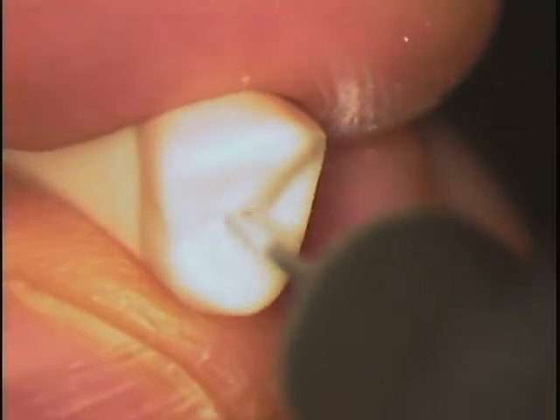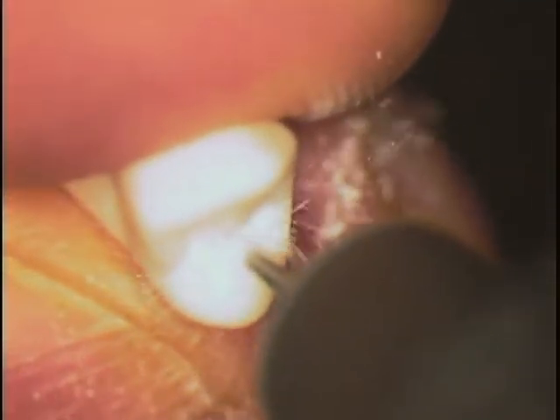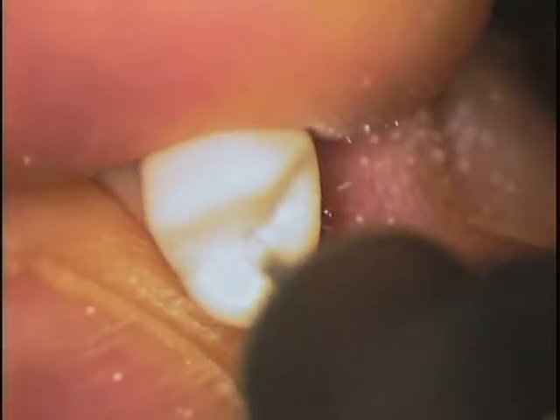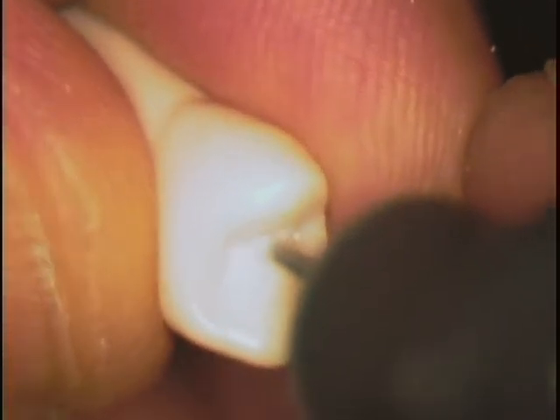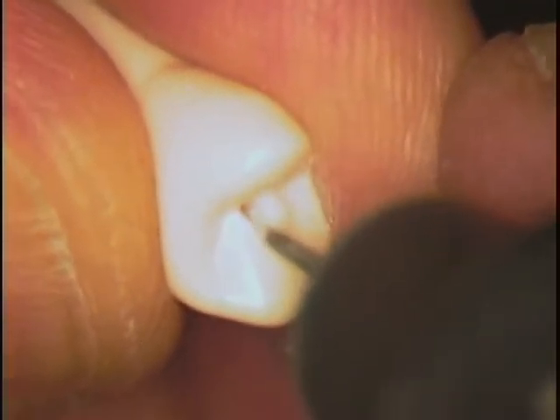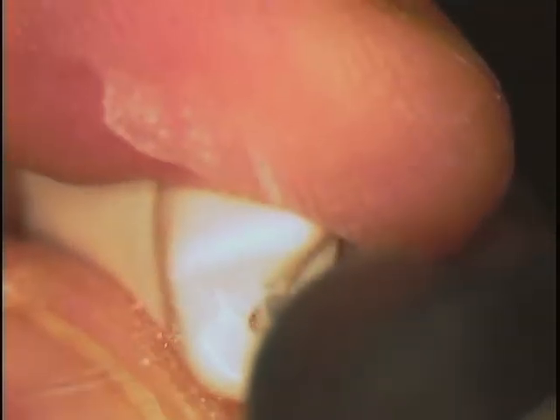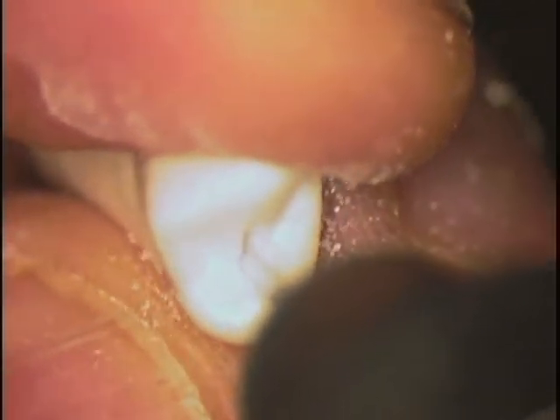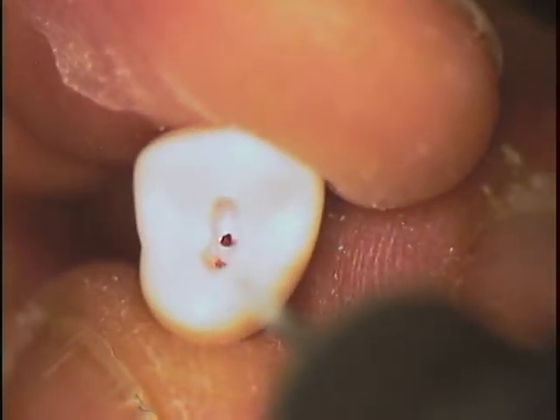So in you go, stay with the long axis of the tooth, and just start slotting it. I'll try to go straight lingual. Okay, and then turn it around and just bring it to the buccal. Now, some of you might start going back and forth, creating the oval. Sometimes you go off the road a little bit, don't worry about it.